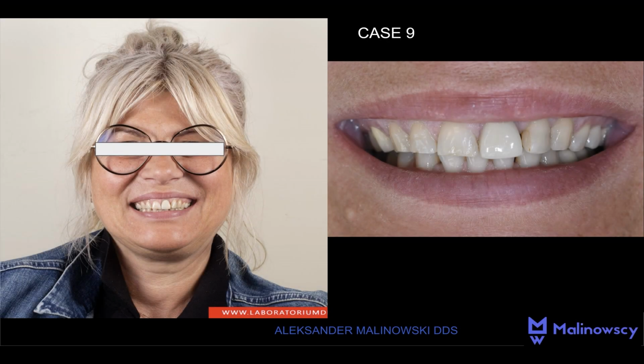Okay. So next patient presented with poor aesthetics of the teeth. Simultaneously, she suffered from severe headaches and back pain. She had an old prosthetic crown on tooth 2-1. Please note the unilateral pathological wear, as I assume the old crown was matched to the length of the teeth before.